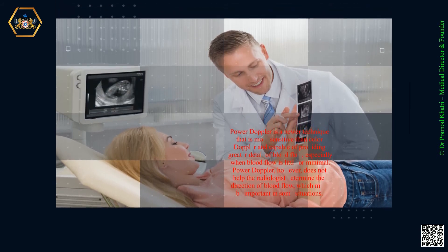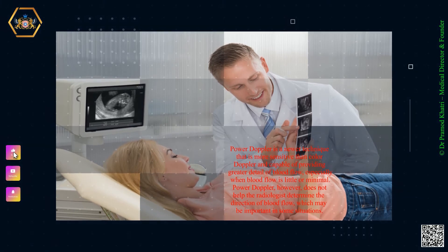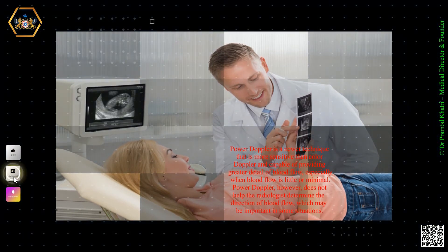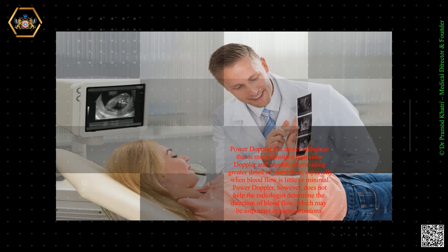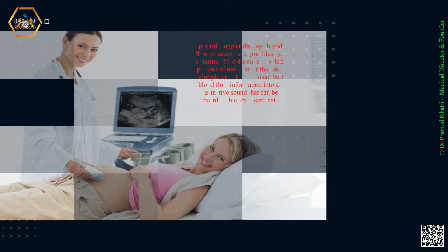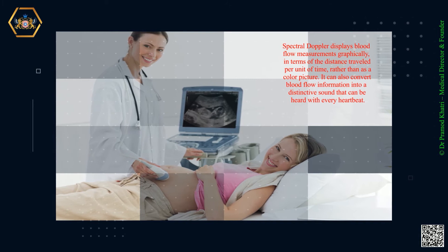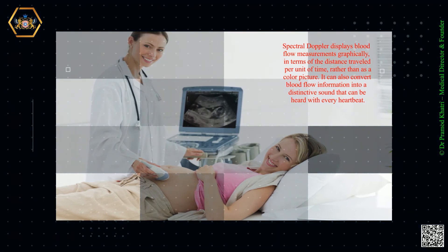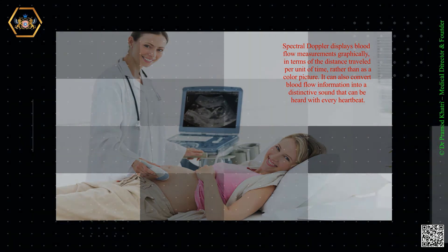Power Doppler is a newer technique that is more sensitive than color Doppler and capable of providing greater detail of blood flow, especially when blood flow is little or minimal. However, Power Doppler does not help the radiologist determine the direction of blood flow, which may be important in some situations. Spectral Doppler displays blood flow measurements graphically in terms of the distance traveled per unit of time rather than as a color picture. It can also convert blood flow information into a distinctive sound that can be heard with every heartbeat.